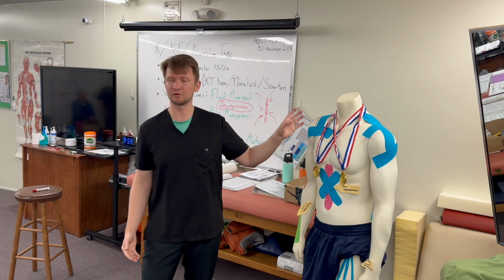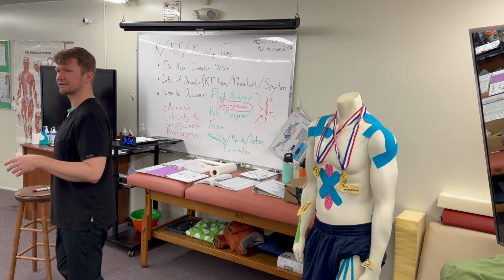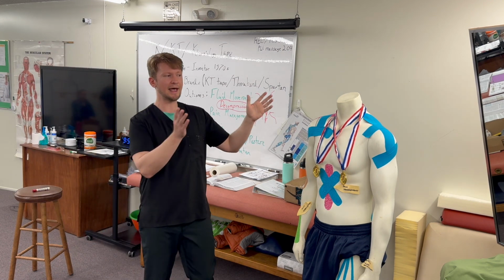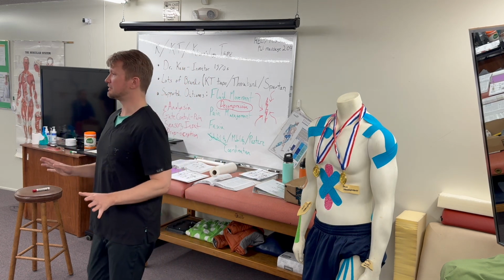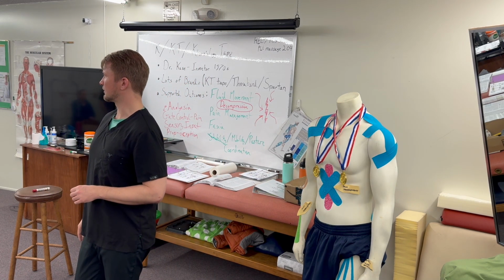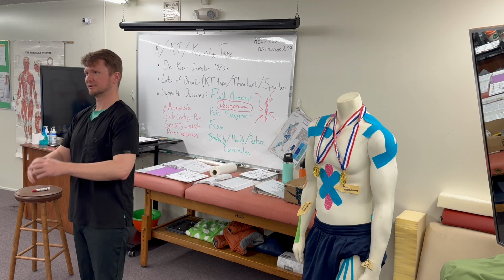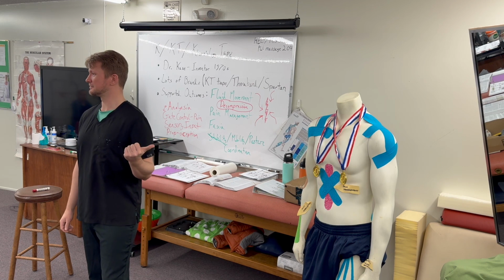This is how it gets used more often in physical therapy. It tends to be that you do your exercises, and then there's taping put on, and the idea being that the tape helps encourage the body to keep whatever therapy going that you did. So especially with fluid movement and connective tissue pliability, fantastic, because it can be left on for days.